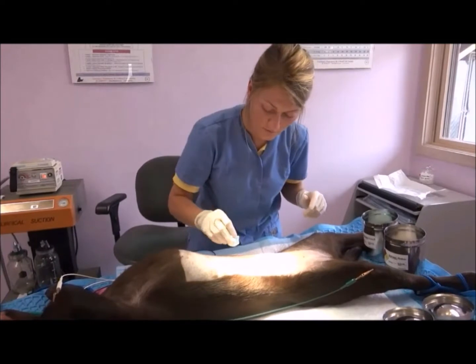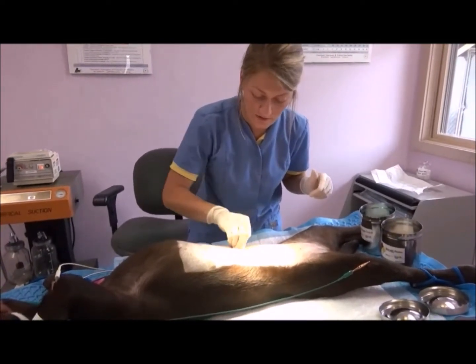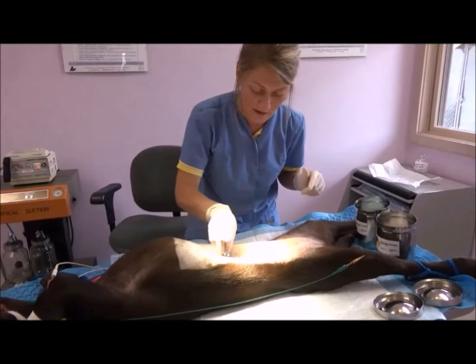So I'm just going to fold in the corners, and once again I start at the incision area using that same target scrub pattern.